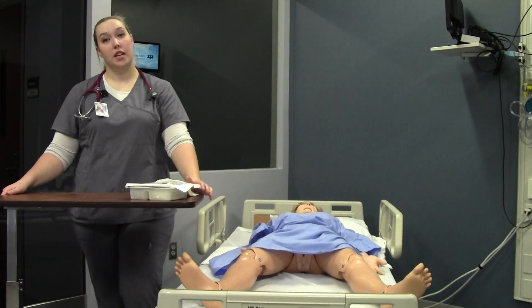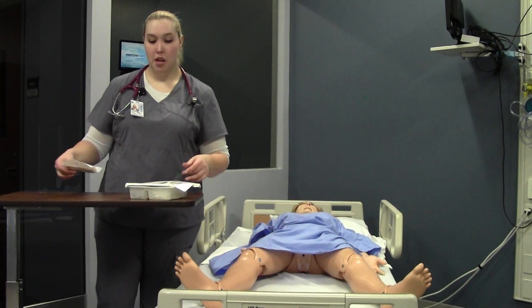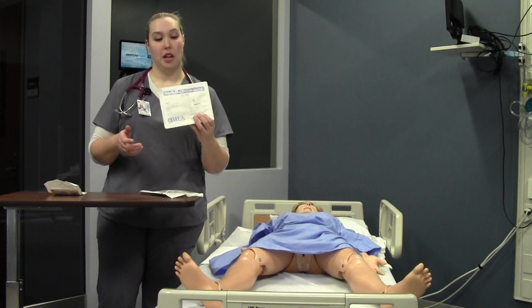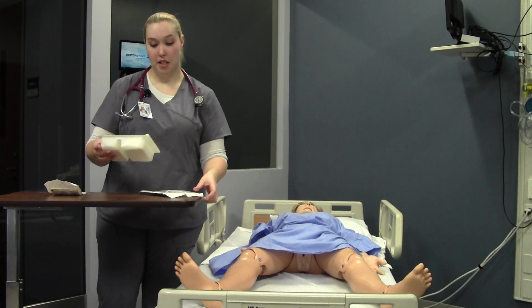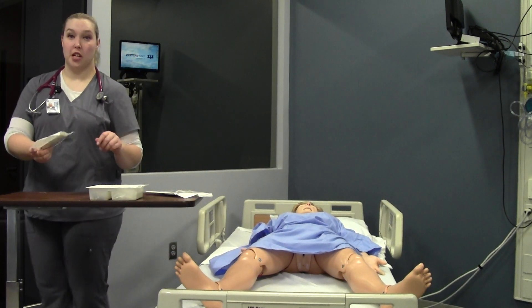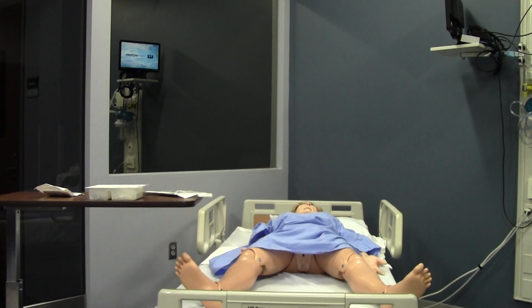Today I'll be demonstrating tracheostomy cares. The supplies that you'll need for the skill: you'll need your tracheostomy clean and suction tray kit, your suction catheter kit. I always bring an extra pair of sterile gloves, and you'll need sterile saline.